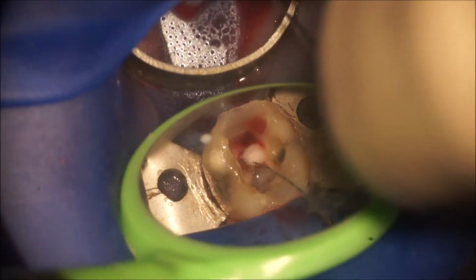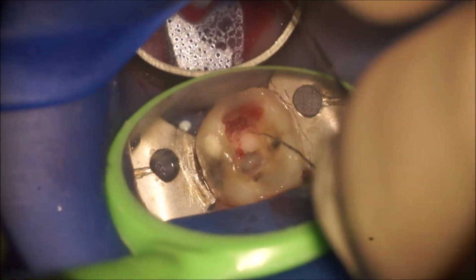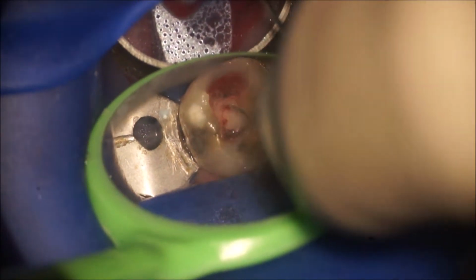The tip of a size 10K file coated in a viscous chelator to stop the blood from clotting. We don't want blood clots forming, obstructing the canal, especially because this seemed to have been a very rich vascular tissue.